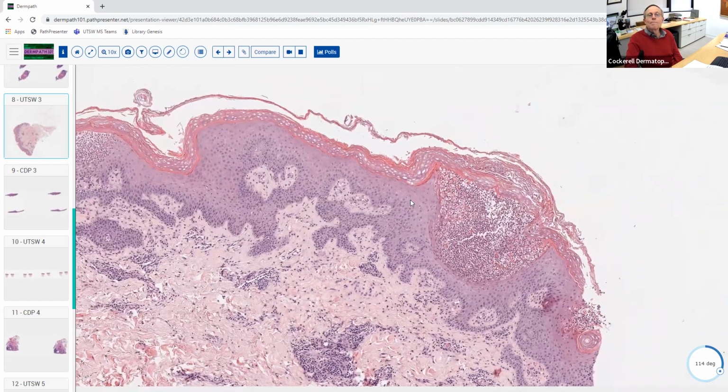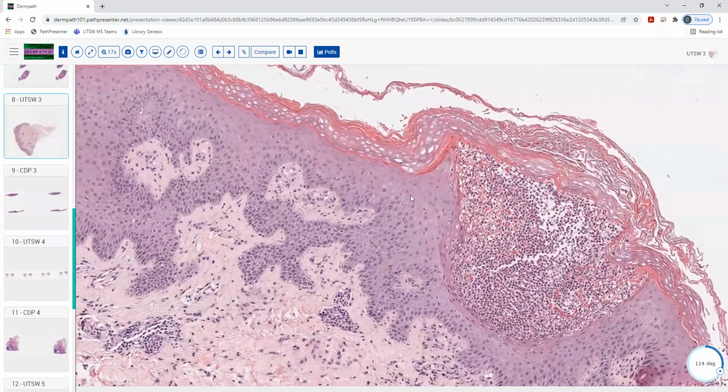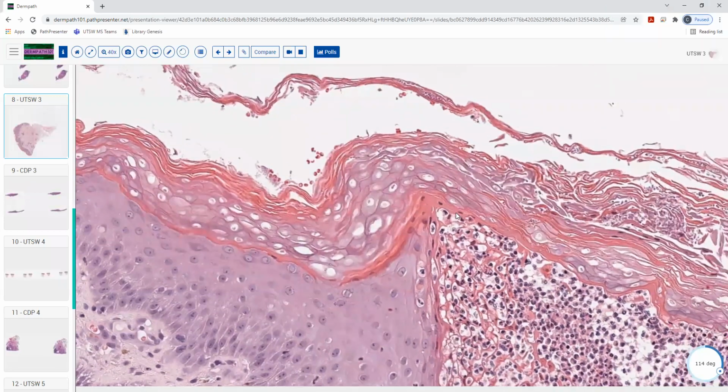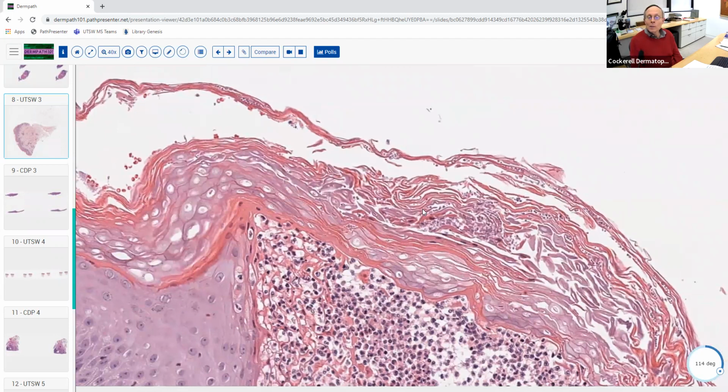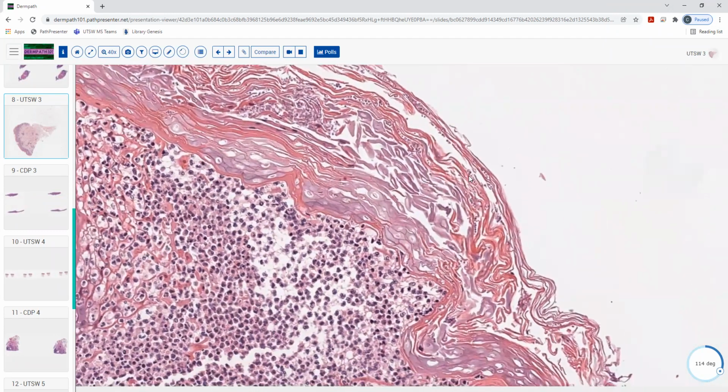I think part of it you'd get with history, like you'd want to know if the patient is in the hospital, a super acute eruption. But just looking at the path, you can also look at the cornified layer and see if you can find any fungal elements or bacteria. Did you see any fungal elements here? I don't know if this looks bacterial to me. Potentially it's a little like hyphae, but I had a hard time seeing it.